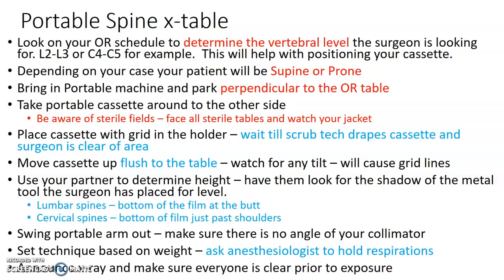I always ask them to look for the shadow of the metal marker that the surgeon has placed, and that's how I determine my height going up and down. Do I need to come up a little bit? So you want to be able to see that marker.